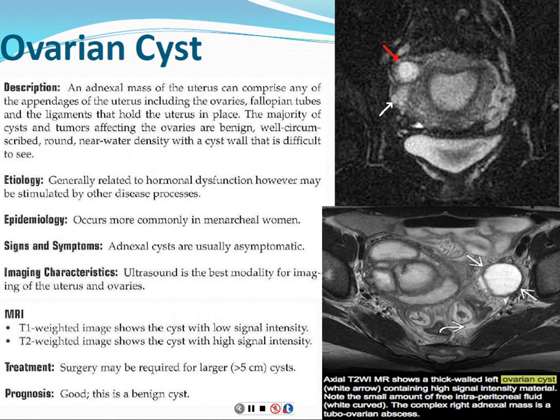The first imaging test you would go to is ultrasound, of course. Many of these you can see on ultrasound well and see that they look like just simple fluid, and once you follow them up, they'll go away on their own in several months. Some of them will stick around for a long time but not change at all. But sometimes you'll see things on ultrasound that may make you feel a little bit more worried, like you want to get more evaluation, for example, with MRI.